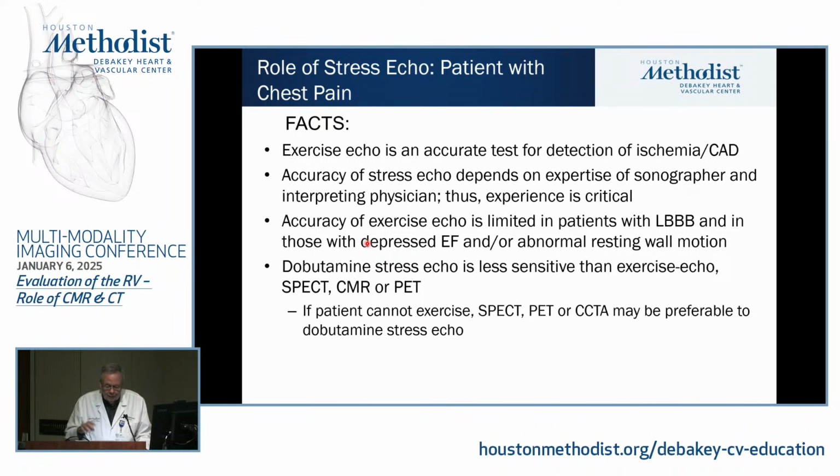Dobutamine is less sensitive than exercise echo. And in today's world, when we have such easy access to nuclear technology and PET and CMR, personally, I seldom use it. I know that some of my colleagues still order it, but if I have a patient that cannot exercise, I would rather go to a nuclear technique.